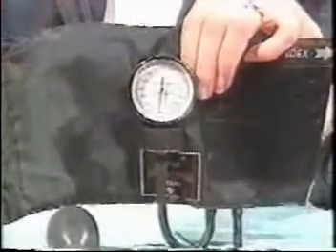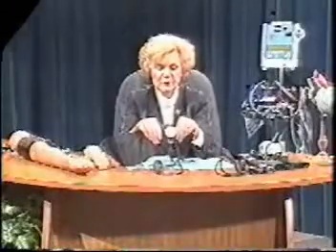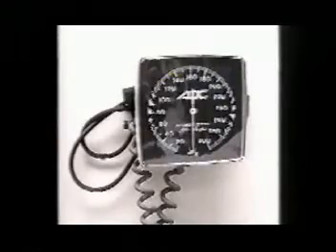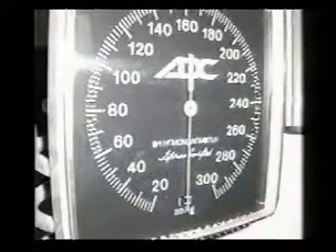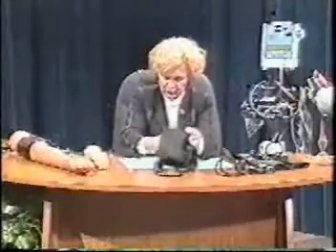It can be handheld or held onto the cuff itself. Sometimes you will see the aneroid type mounted on a wall, and you would be using the pressure gauge from the wall.